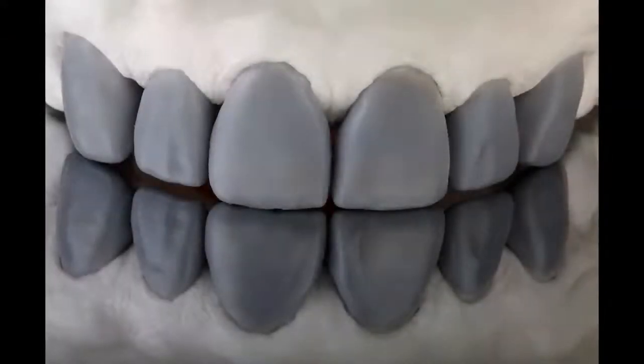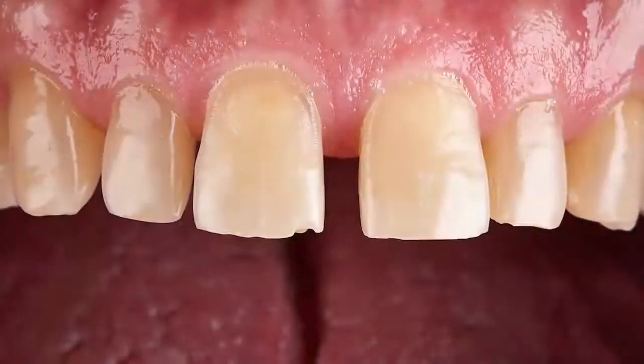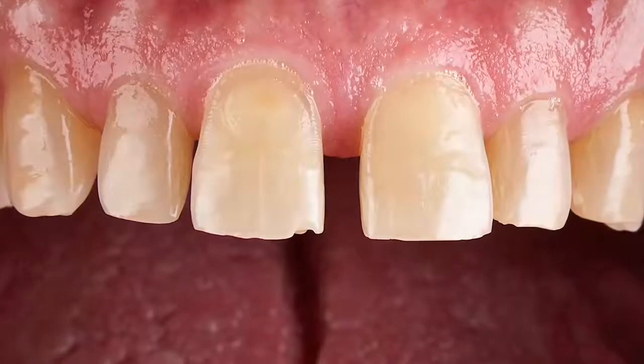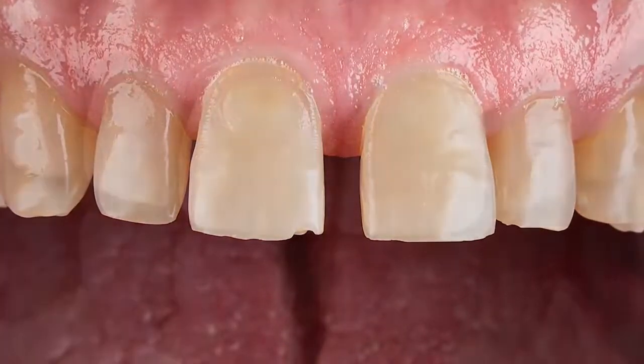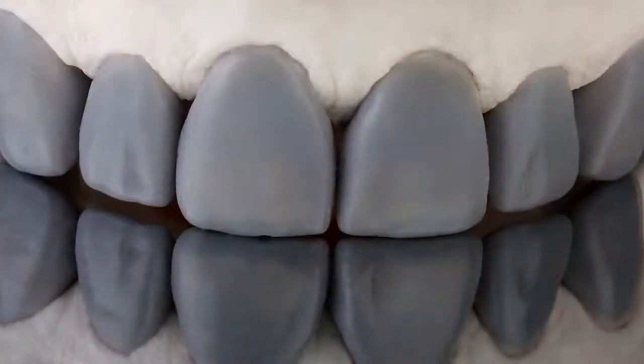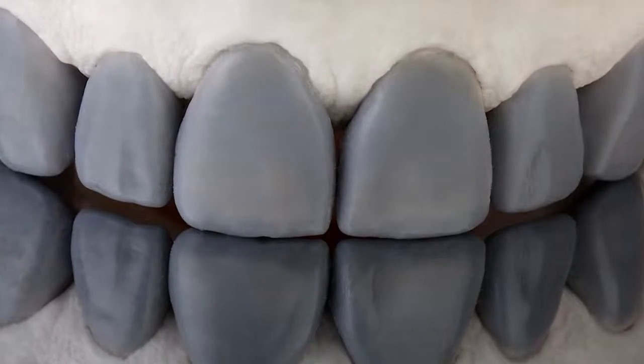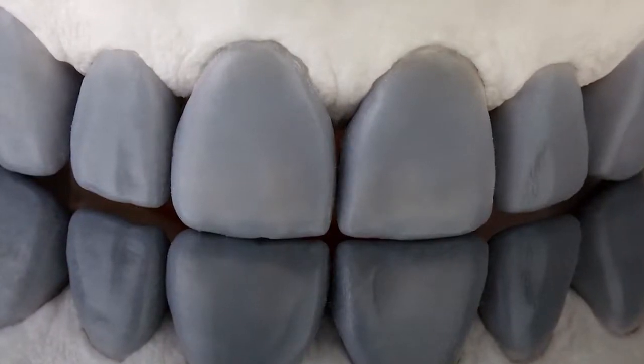A method to eliminate voids with pressure. A diagnostic wax-up was used to establish new aesthetic and functional parameters for the definitive restorations: occlusal function, tooth position and alignment, restoration shape, physiological contour and texture, incisal edge position, and gingival orientation.